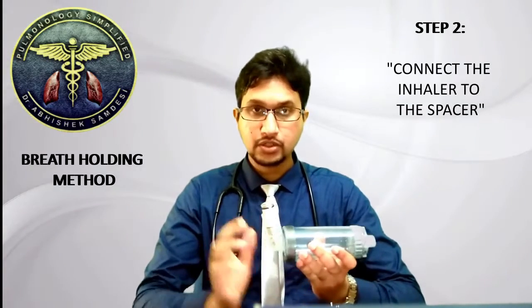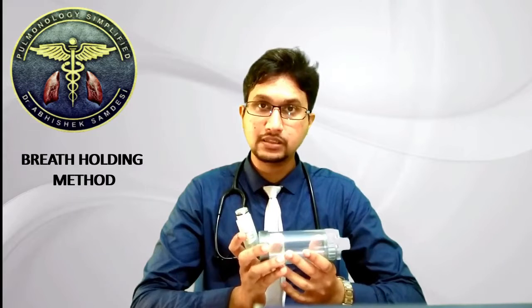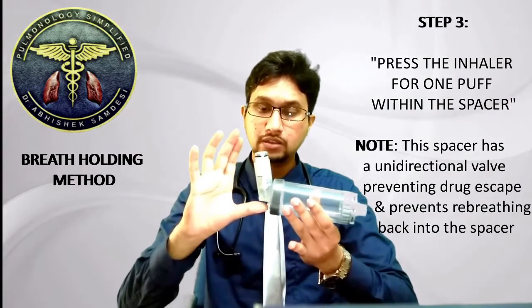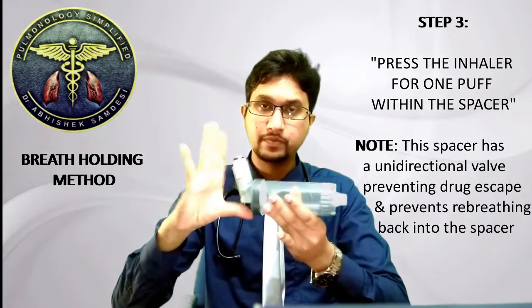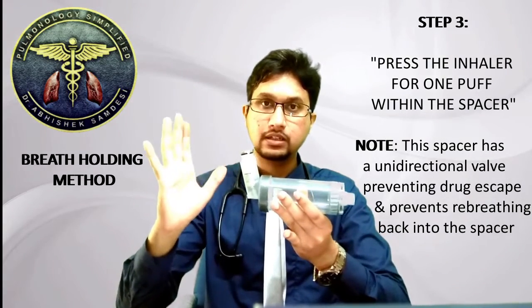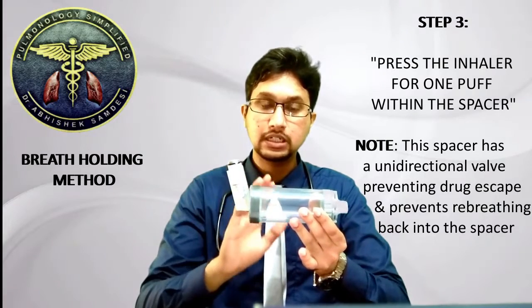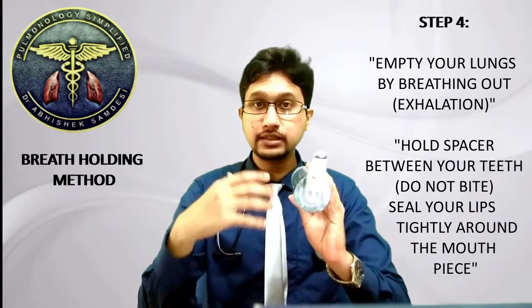Make sure it is connected properly. Prefer a spacer which has a unidirectional valve at the mouth end. Hold your thumb below the inhaler and press it firmly. What happens is the drug gets trapped inside the spacer.